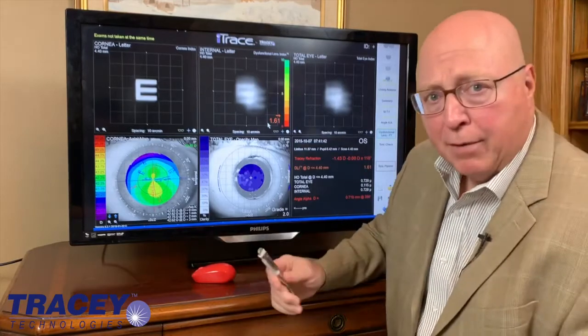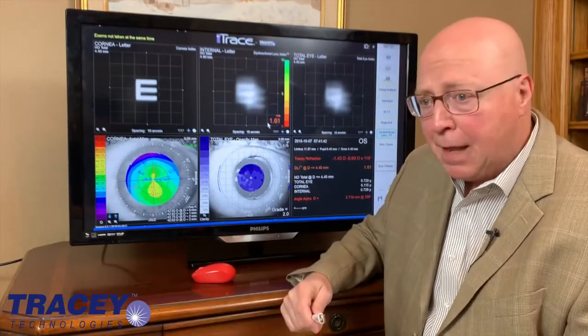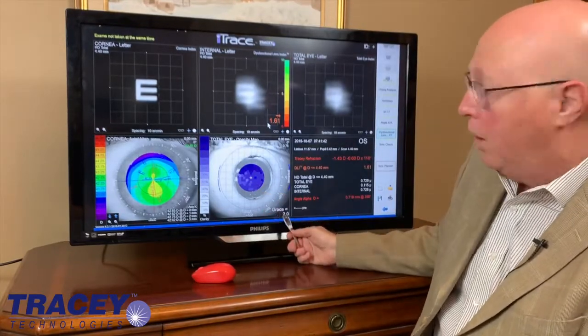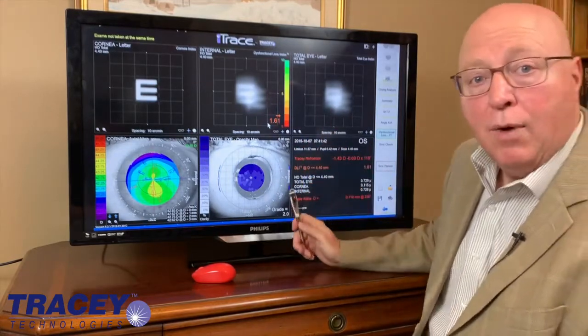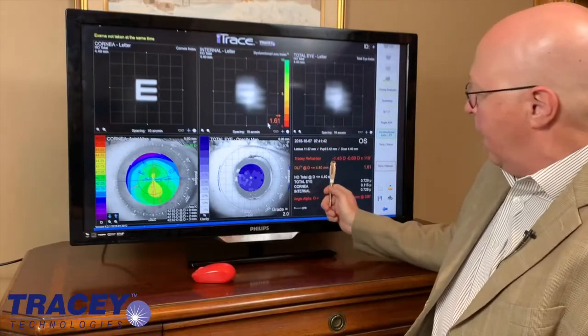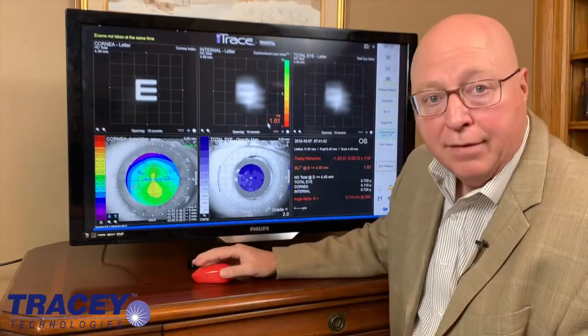So this is a patient I was actually fortunate enough to be in when the patient was coming in for a YAG, and we mapped the patient first. Let's see what we see. You see opacity grade is 2.0, the vision's very poor, and the patient's not happy, and the refraction's in red, meaning what? High order aberrations. And they have about a diopter and a half of nearsightedness and about a half a diopter of astigmatism.